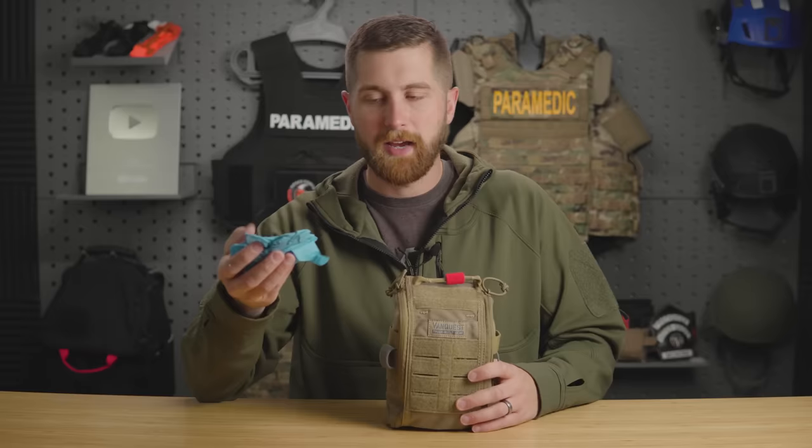You can throw these on. Just know that if you can't put these on, you have intact skin. Your skin is actually a great barrier for disease. Just make sure you're washing your hands. I'm not recommending you do that. PPE is the best practice, but you probably won't catch anything if you don't have any cuts on your hand dealing with a run-of-the-mill patient.